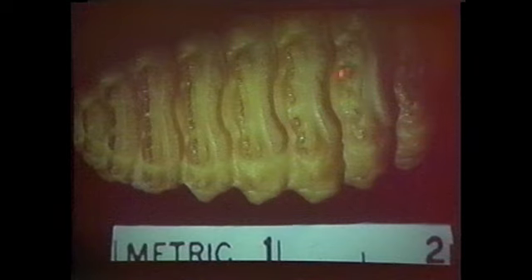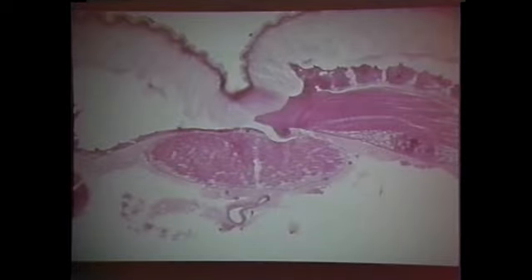Bots and maggots, which are larval flies. I just love this. I call it Dracula. Anyway, they have spines on the cuticle, and you certainly can pick that up in your histologic section. And let's say everything is degenerated and you see some spines, you could possibly make the diagnosis. Look, this has striated muscle as well.